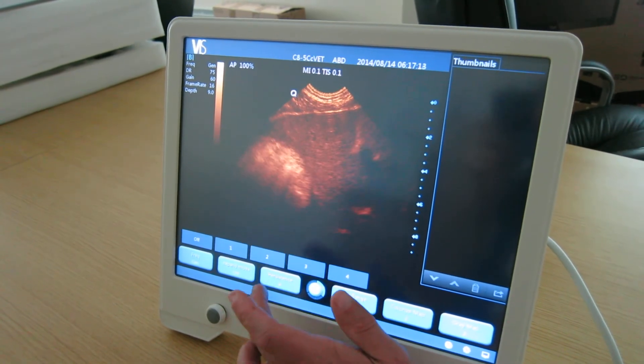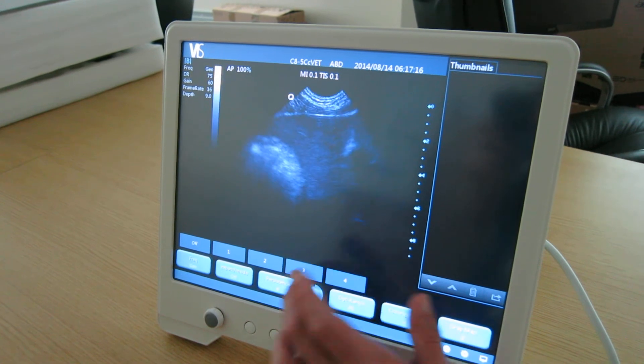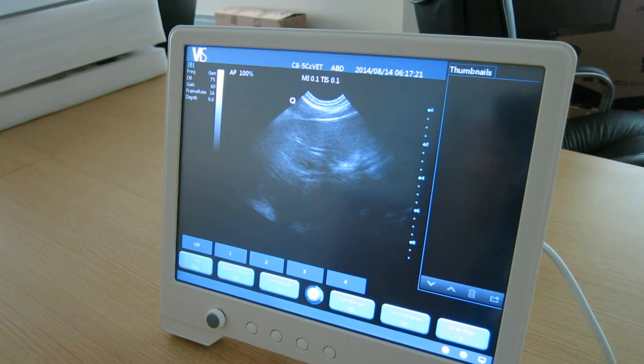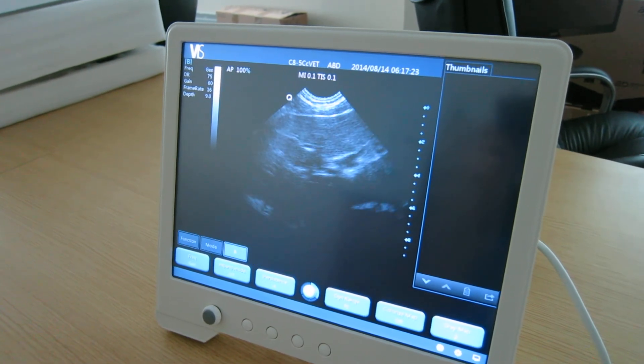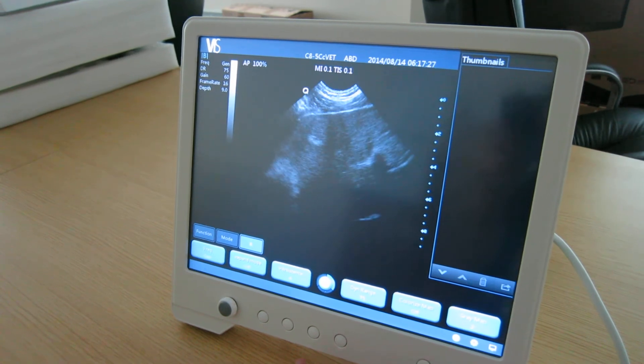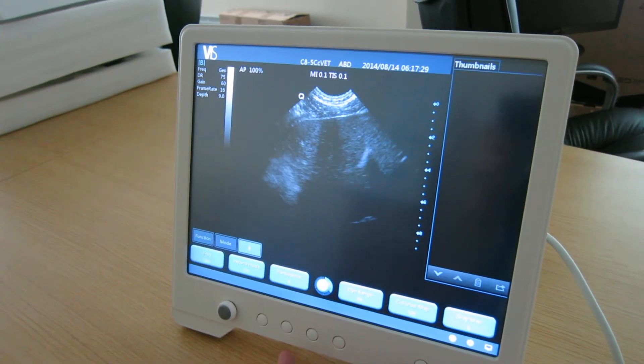It has colour map if required, but obviously most people will be scanning in greyscale. Very straightforward, easy to use machine. One touch button for freezing.